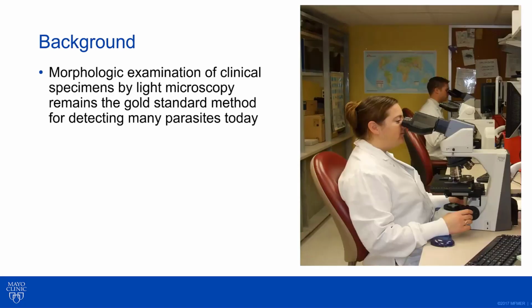So let's talk a little bit about the background of parasite detection in the traditional clinical parasitology laboratory. Now, morphologic examination of clinical specimens by light microscopy remains the gold standard method for detecting many parasites today. And you can see on the right, I have an image of two of our technologists looking in the microscope for parasites, screening blood and stool.